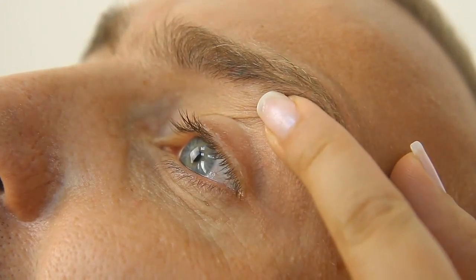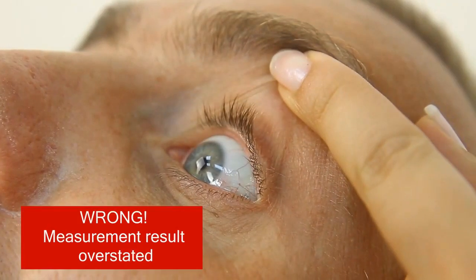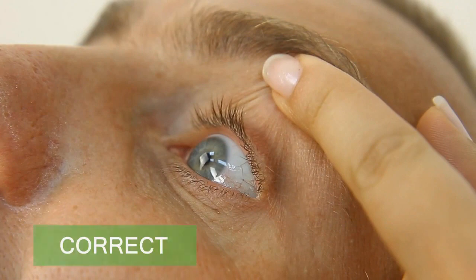The eyelid is stretched incorrectly — possible mistakes. The eyelid edge is below the limbus and touches the cornea, or the eyelid edge is too high above the limbus. For precise measurements, the eyelid edge must be 1 mm apart from the limbus.